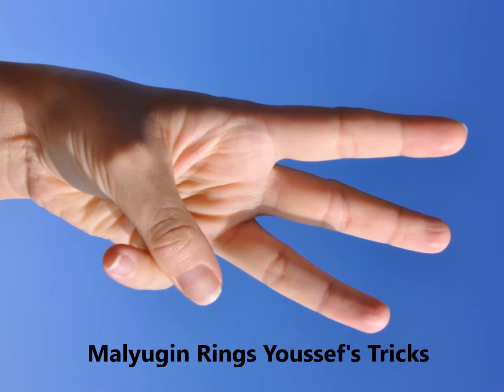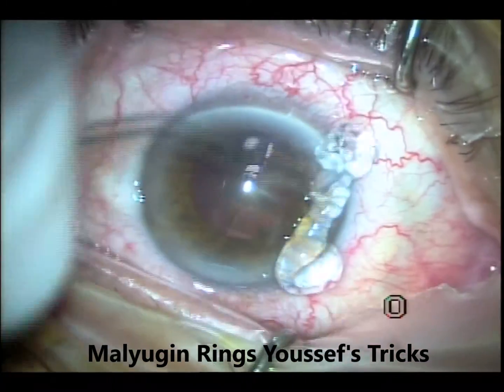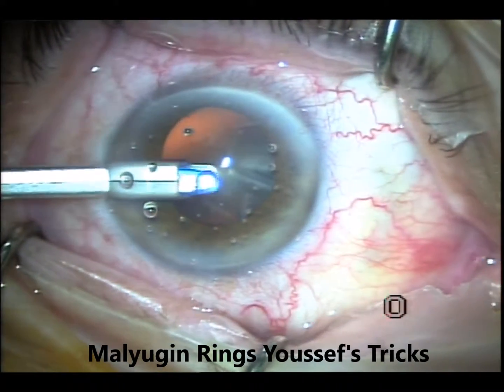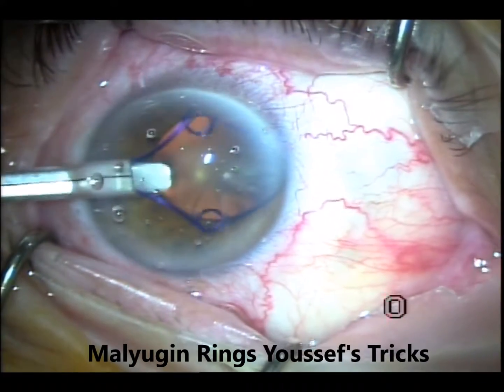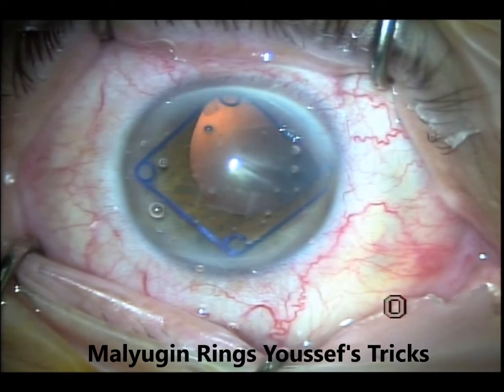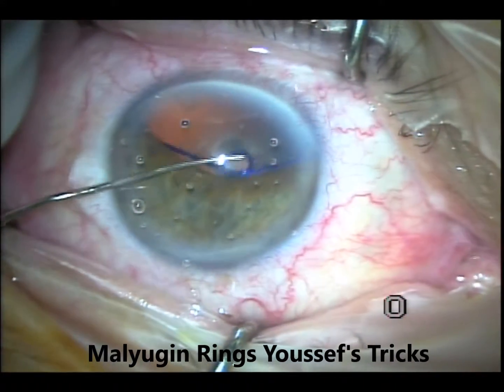This is the third case — again, all done on the same day. It's my way to manage small pupils. This is xylocaine with epinephrine, viscoelastic, and I put some on the cornea — paracentesis. I'll try to engage the temporal, the nasal one, and engage the upper and lower ones. If they engage, well and good; if not, just leave them. With the Lester hook I will engage the temporal scroll first, because the sub-incisional is the most difficult one to engage, and go from the more difficult to the easier.